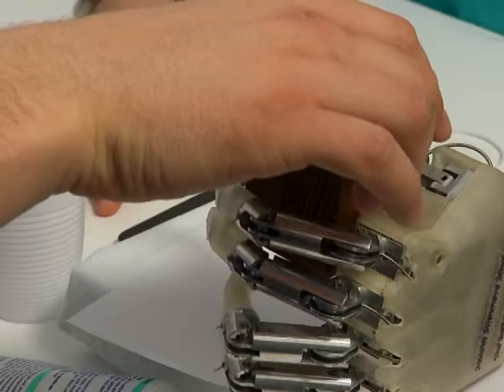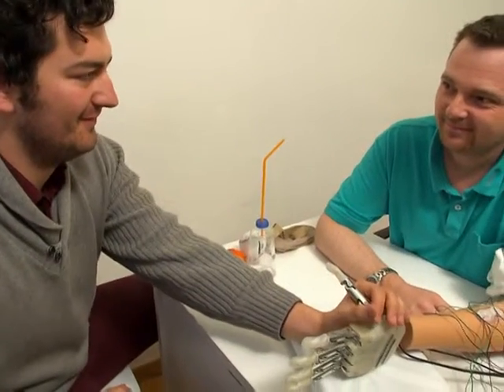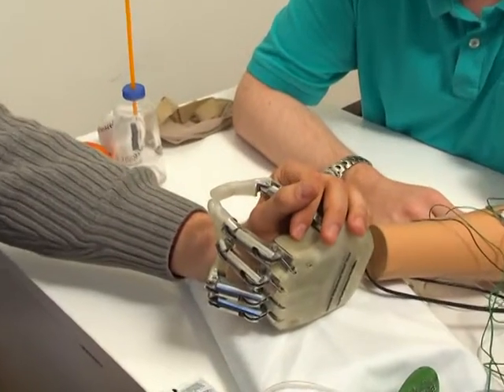Hard. The most exciting moment during these many hours of experiments was the one when Dennis said that he feels in the same way the squeezing that he was performing with a normal hand as the one that he was performing with our prosthetic hand. In that moment, many years of our work found their gratification and we were feeling extremely happy.